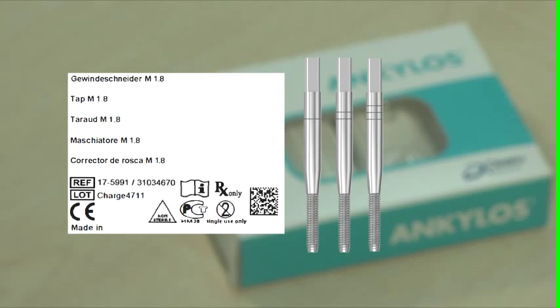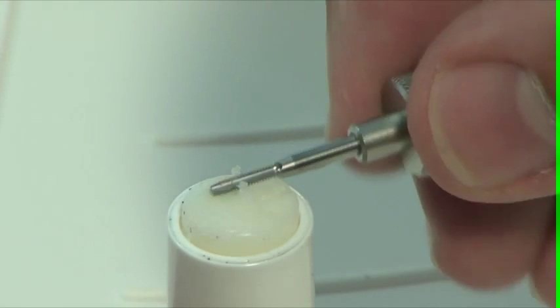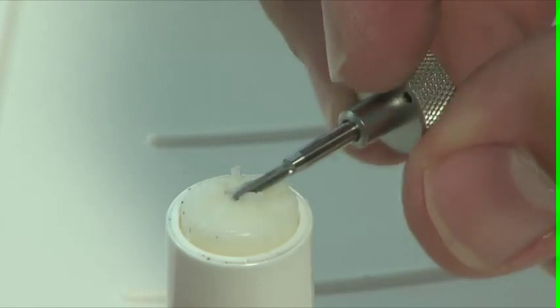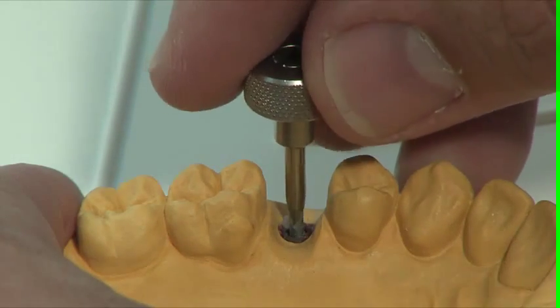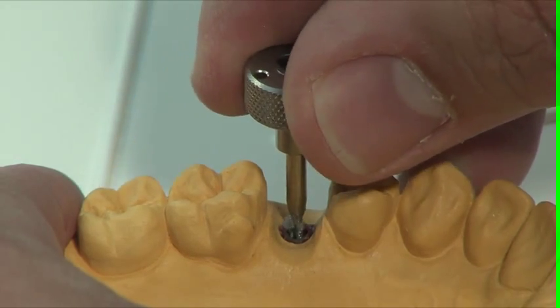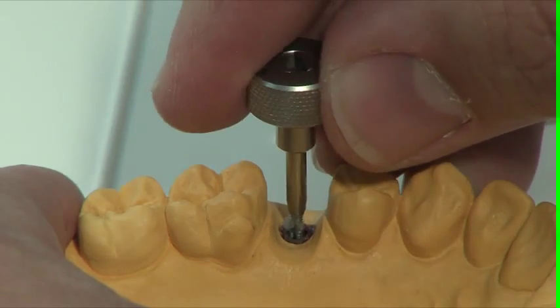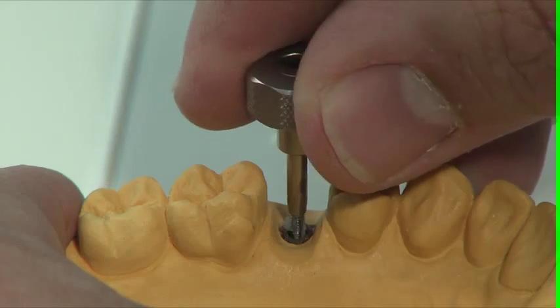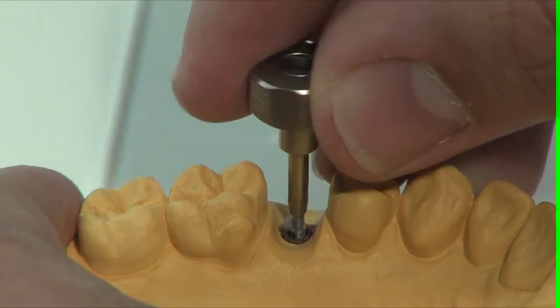The final step involves cutting the thread. The tap M1.8 must also be covered with Vaseline. Take the three instruments with the one, two and three notches one after the other. Proceed with extreme care and do not overload the instruments. This can cause breakages and thus loss of the implant, since it is almost always impossible to remove the part which has broken off from the wall.